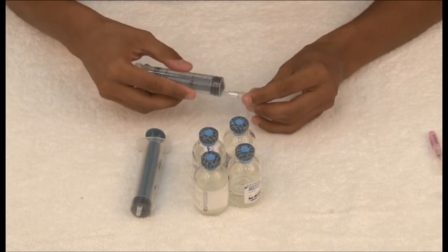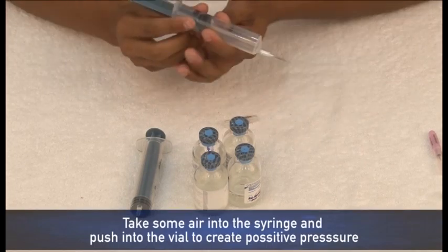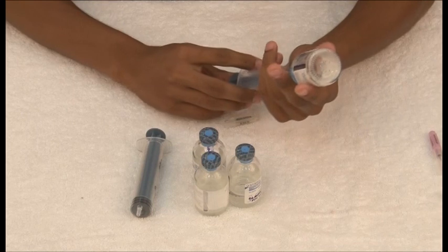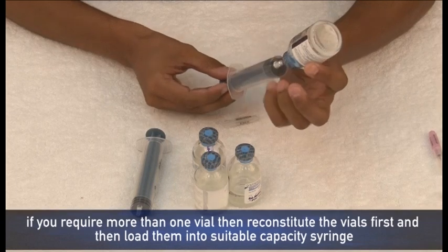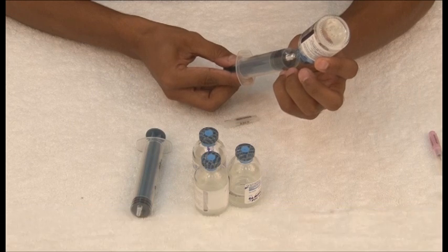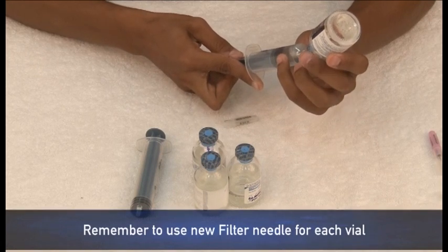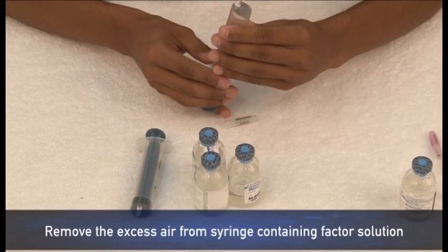Attach the filter needle onto the syringe and remove its cap. For easier withdrawal of the reconstituted solution, insert some air into the vial to create positive pressure — this will facilitate the withdrawal of fluid into the syringe. Draw the factor into the syringe. If you have multiple vials, you may use a larger syringe such as 20 ml. After drawing in the factor, expel the air out of the syringe.